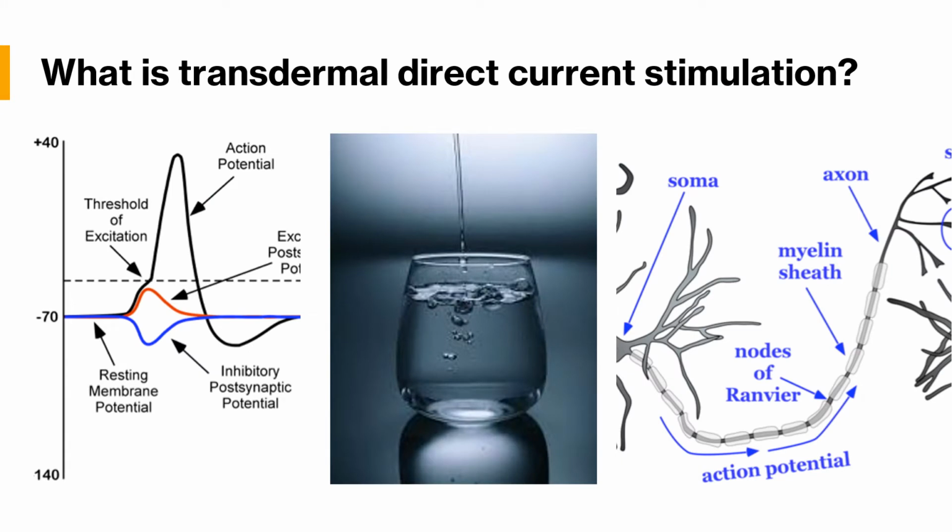For an action potential to initiate, the input must depolarize the cell enough to reach the threshold of excitation. And as part of the all or none law, not every input is strong enough to tip this threshold to release the action potential. In a maladaptive network, the signals that we want to initiate might not be strong enough to reach that threshold. So instead of sending an action potential, the signal dies in the cell without sending its intended communication. If you can imagine the cell is like a cup that must overflow to send its signal, anodal tDCS fills that cup in the neuron just enough so the biological signals that would otherwise not be strong enough can make it through to their intended destination.